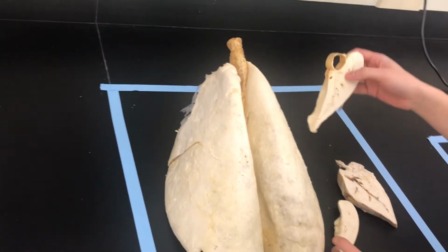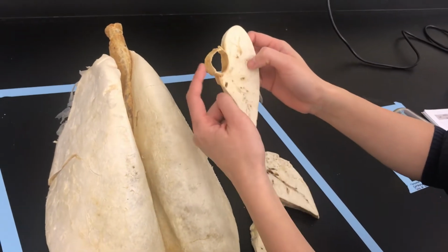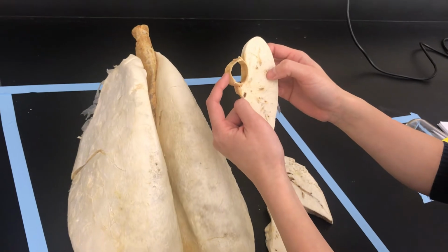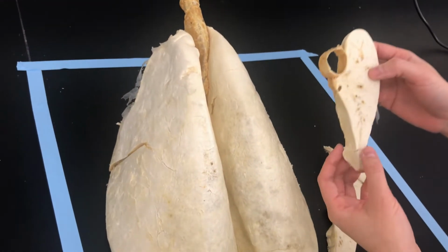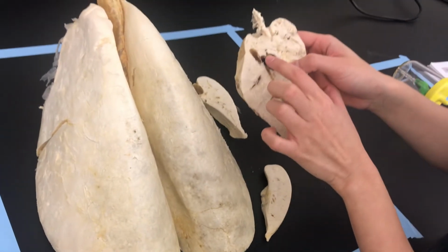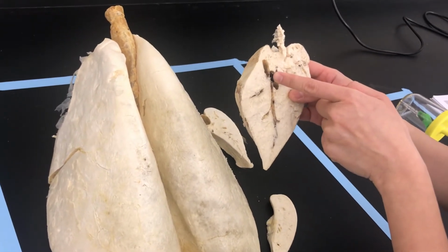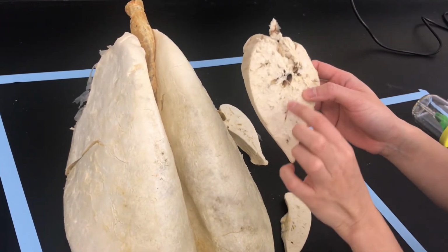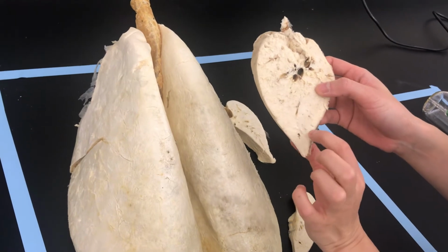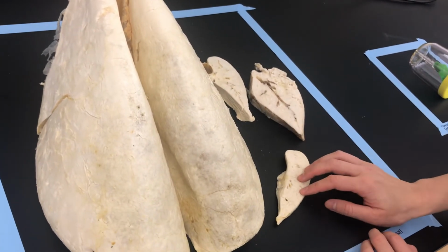Over here, we can see cross sections of this particular lung. Okay, this is a bronchus. It's not the trachea because you can see it's already touching the alveolar tissue. Within the alveolar tissue, you can see some smaller bronchi. So if they have cartilage, they're smaller bronchi. If they don't have cartilage, you can see bronchioles that go right through into the alveoli, and it's super, super soft here. Okay. All right, so moving on.